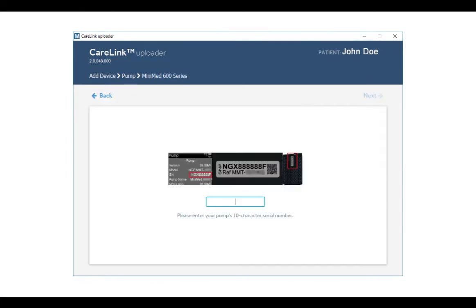Type in your pump serial number. Find your pump serial number on the back of the pump, type in the serial number, and click Next.